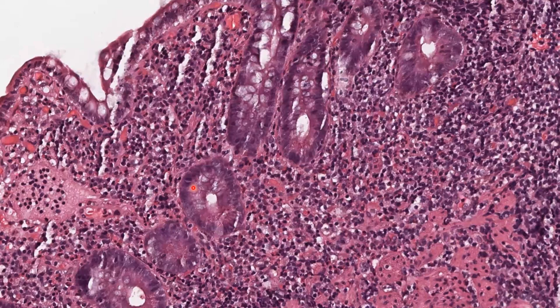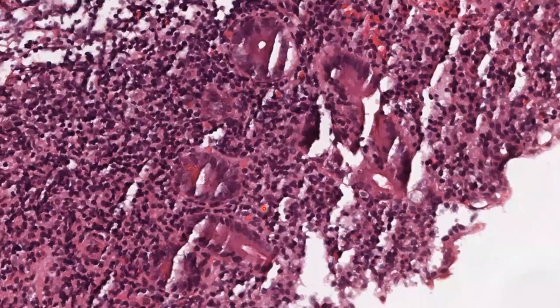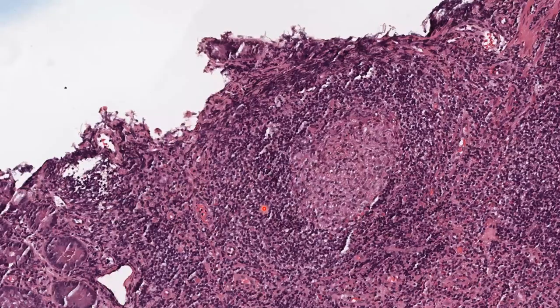Here you are trying to make up for Paneth cells, but you can't, so don't get dragged into it. Here is one Paneth cell, a beautiful demonstration of these Paneth cells, yes? But again, in the middle of pouchitis, this might be coming from the residual crypts of the small bowel, and I wouldn't even put my money on this.